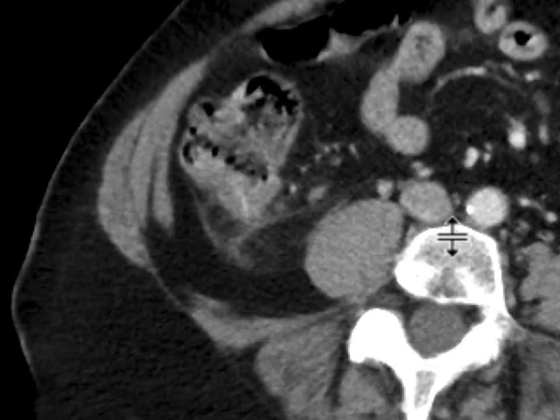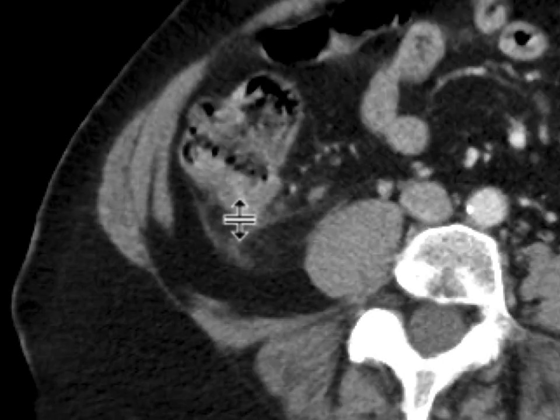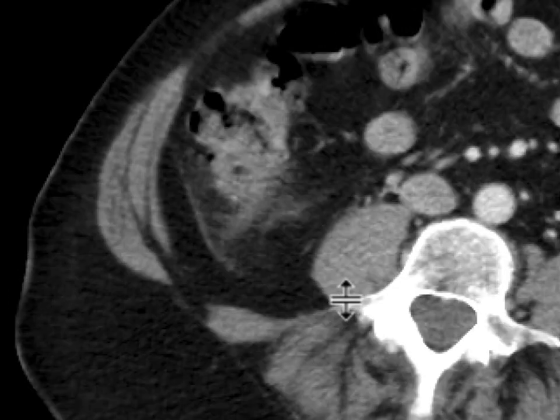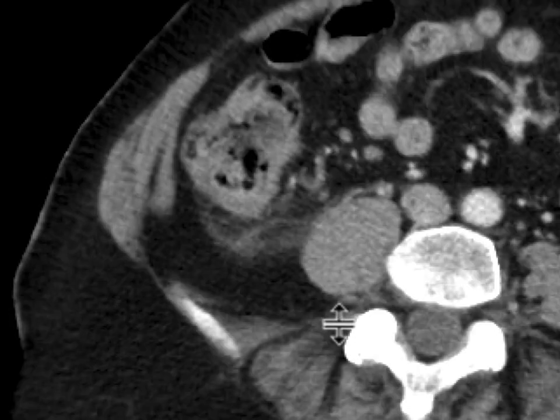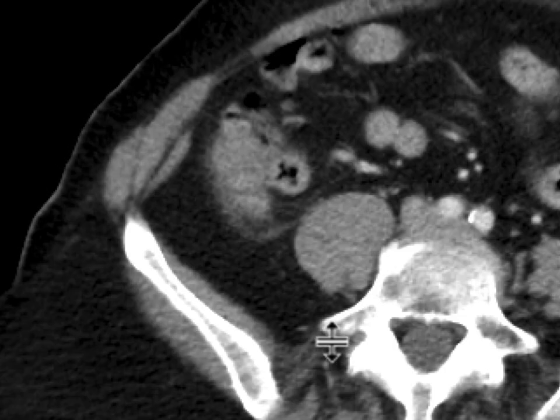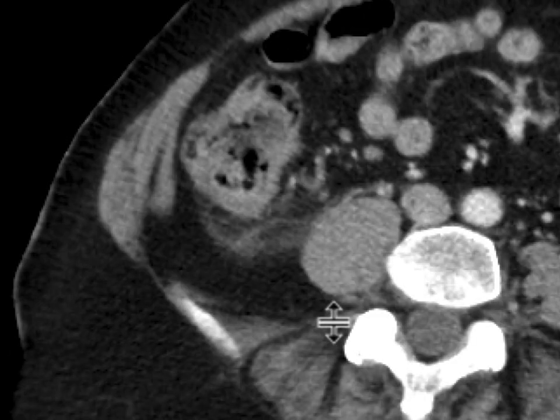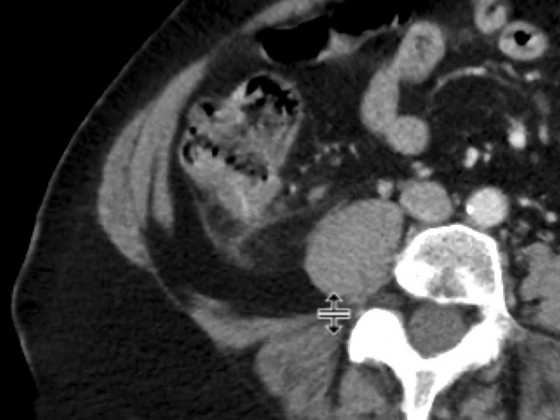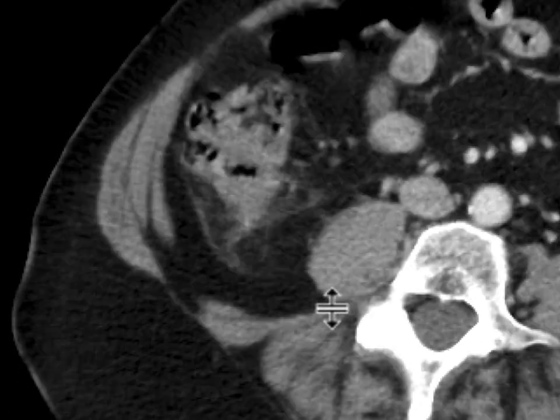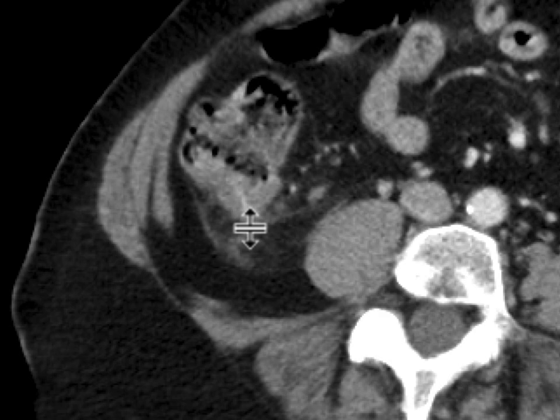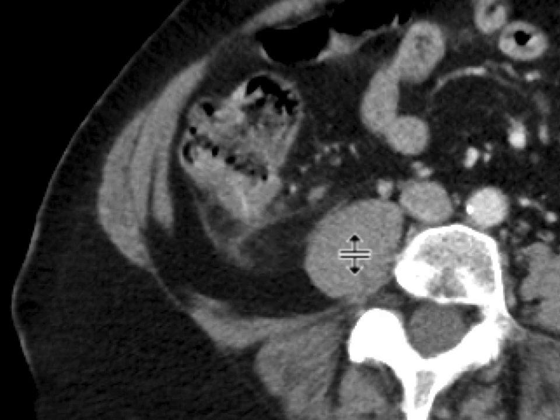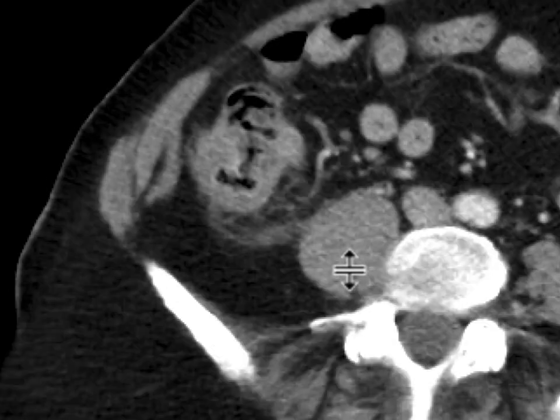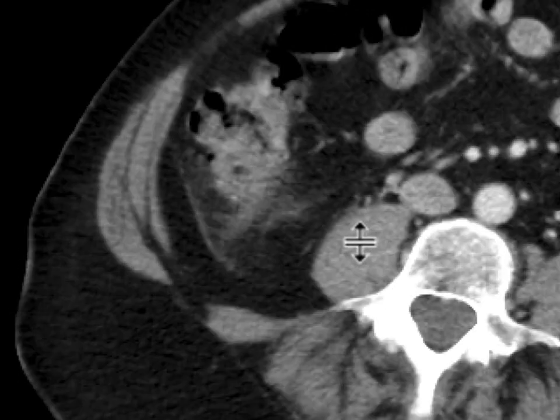If we look very closely, we can see that there's a little sharp object, a high-density object, that's sort of protruding out from the cecum going outwards, and a lot of that inflammation is centered around this object. There's some bowel wall thickening also seen in this location.